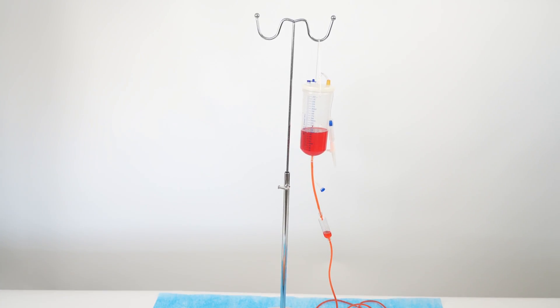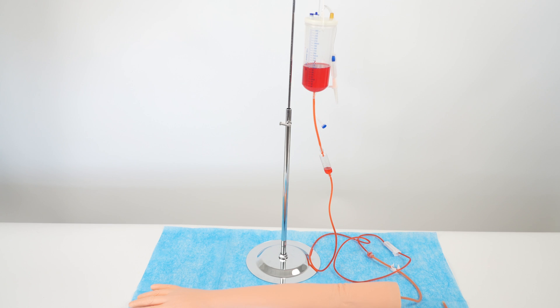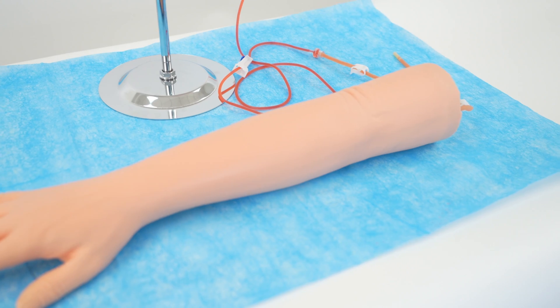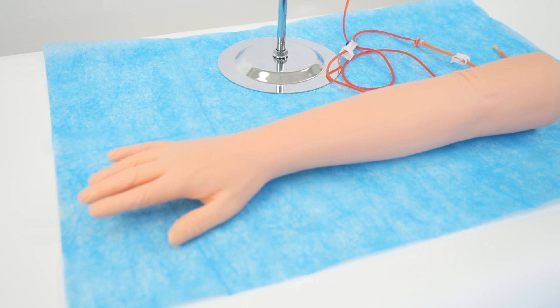Congratulations! Your Alcedo Anatomical IV and Phlebotomy Simulation Arm is now fully set up and ready for simulation procedures. Practice with confidence and enhance your training experience.